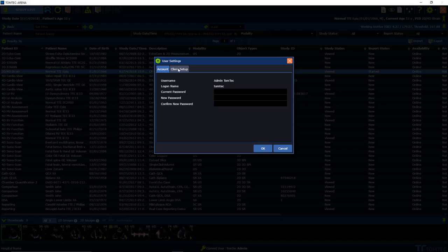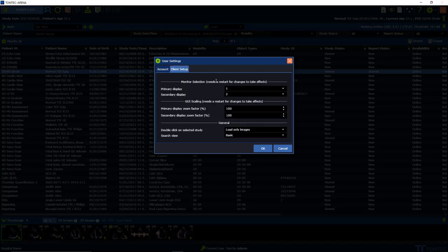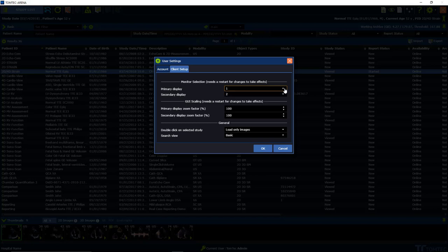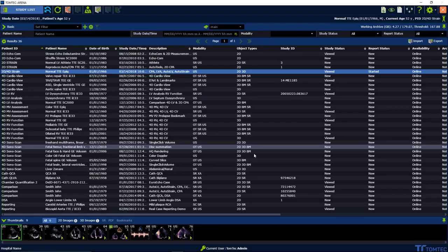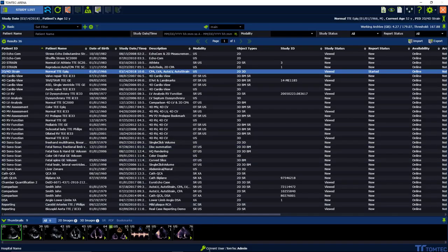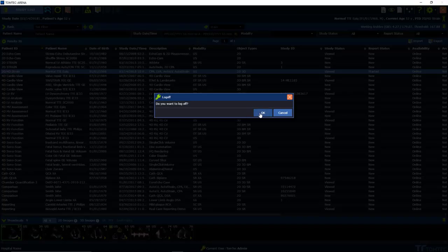Click for it, user settings. On the second page, so-called client setup, we can select the monitor: my primary display and my secondary display. After successfully setting up the dual monitoring, please log off one time to fix the adjustments.